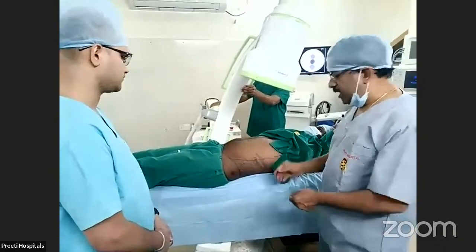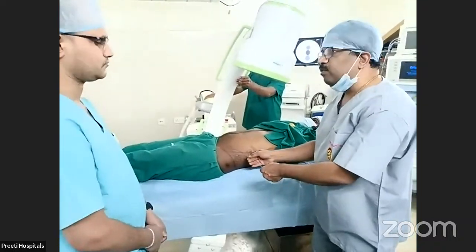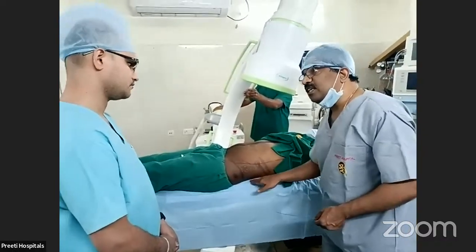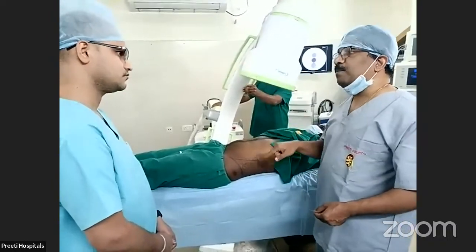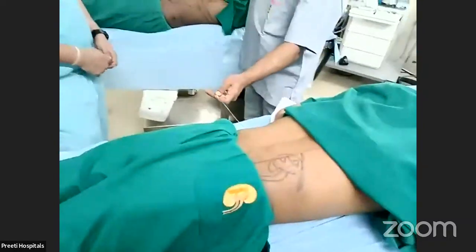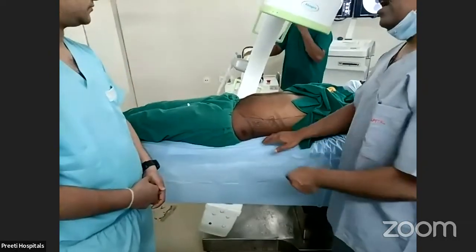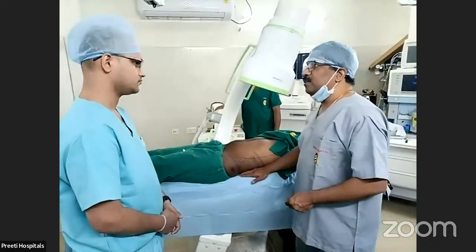Better to stay away. First start from here, then here, then here. This is called gradual ascent. In supine PCNL, first try posterior, then go up. In prone also, first try posterior. Posterior will be superficial, so it is a gradual descent. First you try here, then here, then here. Always be on the back side.